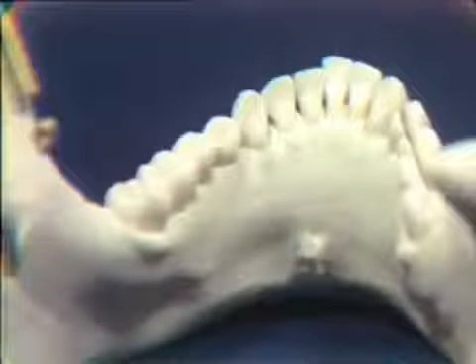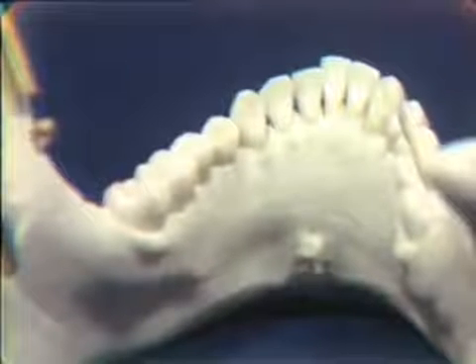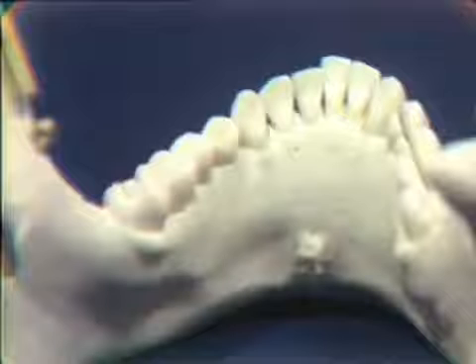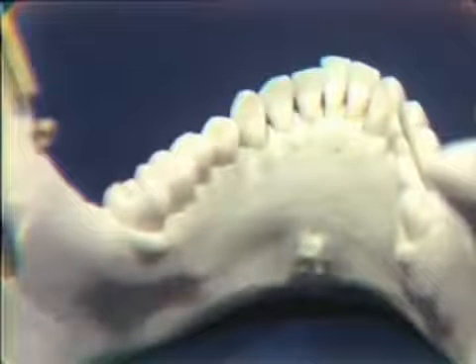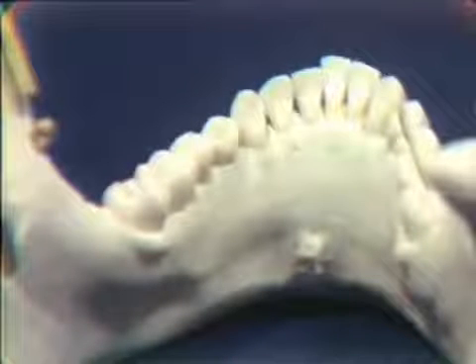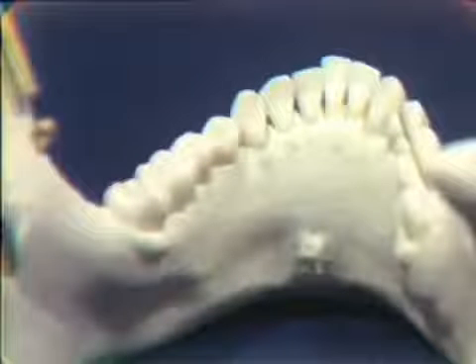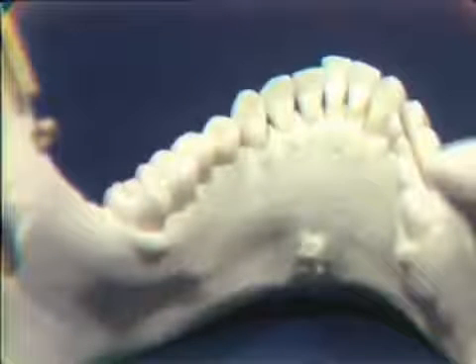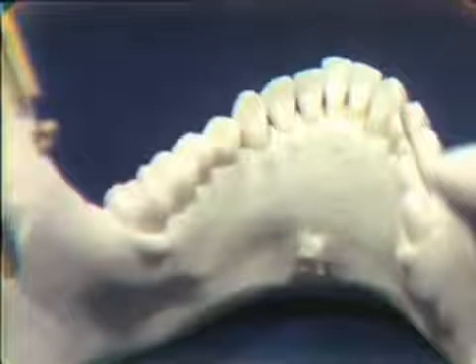Now, we can infiltrate in the floor of the mouth, right at the level of the cuspid, where the tissues of the floor of the mouth sweep onto the alveolar ridge. And again, it is not necessary to make deep penetration, just 2 or 3 to 4 millimeters below the surface of the mucosa, and inject approximately a half a cc of solution, which would accomplish anesthesia of these lingual alveolar soft tissues in such a manner as this.